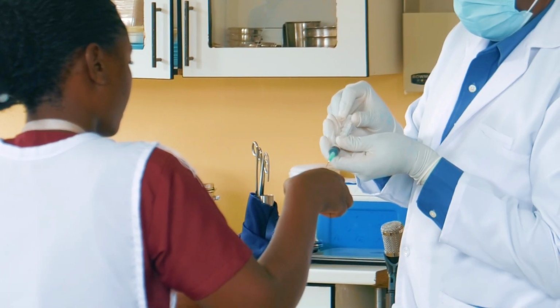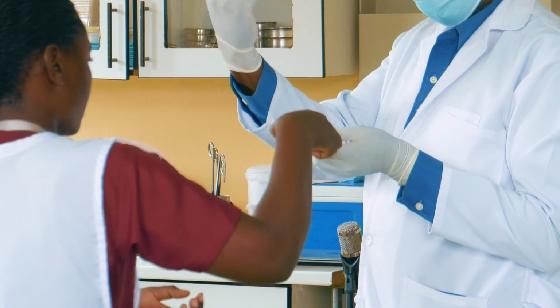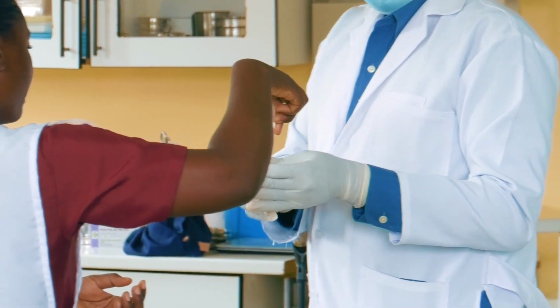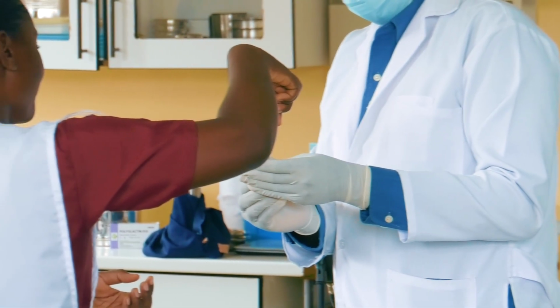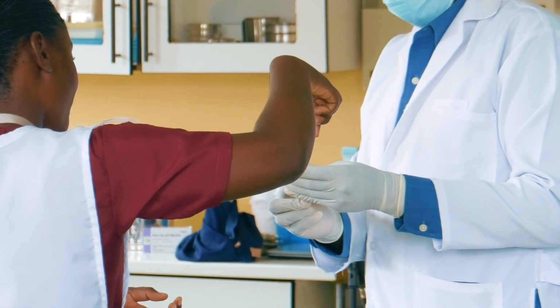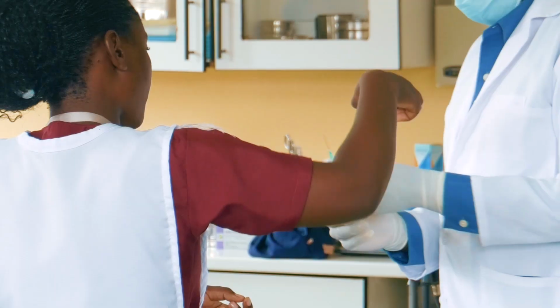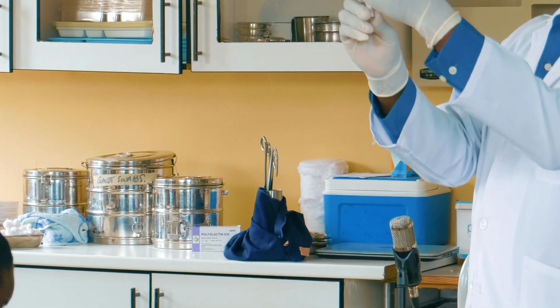Then you turn it. Up, go up, up, up. Draw this, yes. Okay, get the amount that you need. Okay, you can put back, thank you. Everything that you're supposed to do is done. Expel all the air from here, right?